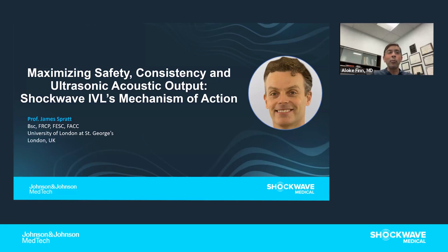I mean, I think they don't really get deep enough into the wall to identify the media. When there's a large intimal plaque, and most of these cases have huge intimal plaque, you can't really see behind it. So I think we're limited by our current imaging technologies in terms of what kind of damage we're doing. But when we go to ultra high pressure, my personal feeling is those balloons probably have a preference to expand on the non-calcified side of the vessel, inducing medial injury on that side away from the calcified plaque.